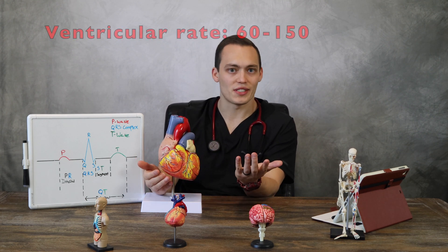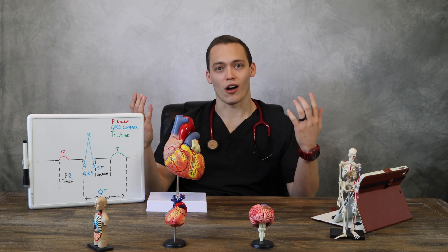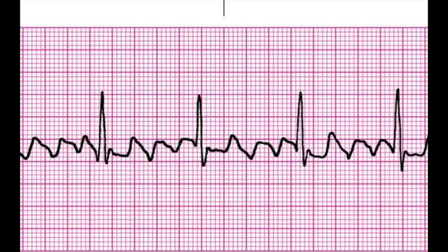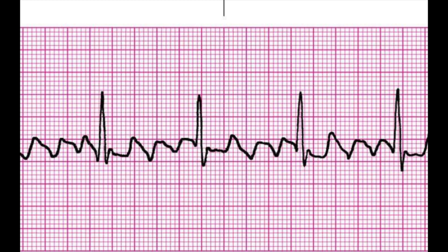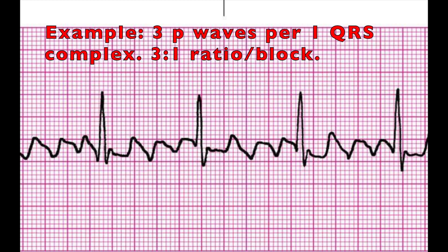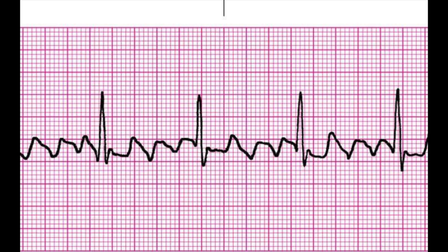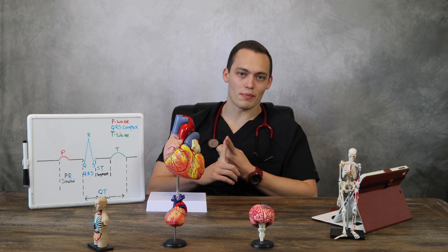On an EKG, atrial flutter looks like a sawtooth pattern. These are P waves, also called F waves or flutter waves, and they can occur at a rate of 250 to 400 beats per minute. You can't really measure the PR interval, but what you can do is measure the degree of AV block by counting the ratio of P waves to QRS complexes. For example, three P waves for every one QRS complex is a 3-to-1 ratio.